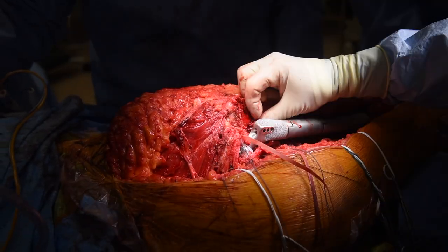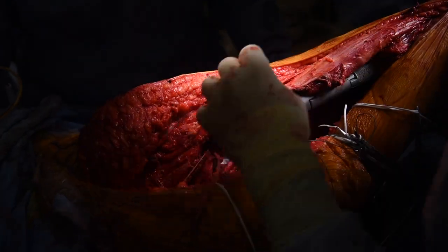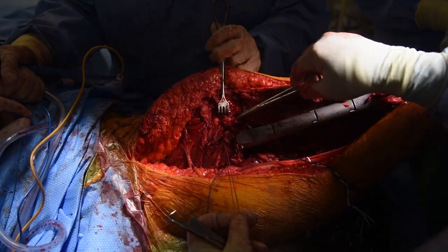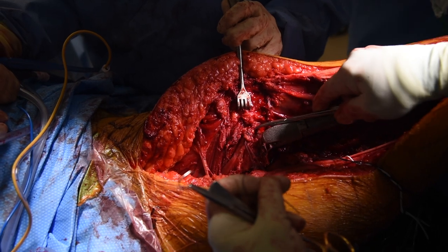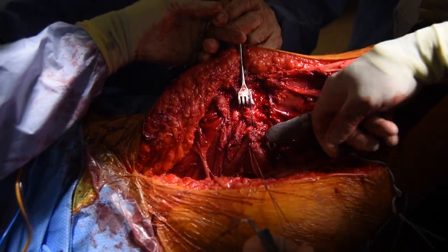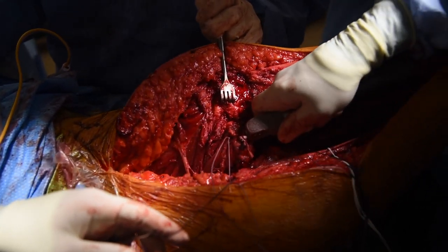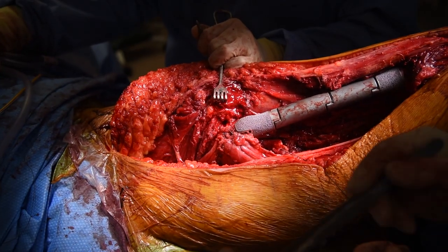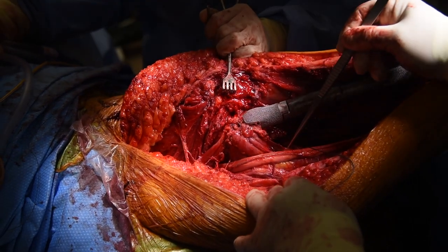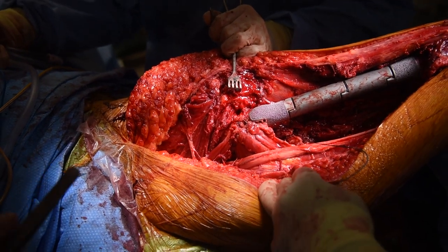The piriformis and iliopsoas muscle are brought together to reinforce the capsule and external rotators over the posterior capsule. We put the hip in abduction to repair the greater trochanter and place sutures through the hip abductors. The psoas muscle is attached to the piriformis and covers the joint capsule anteriorly. We then bring the external rotators around to cover the posterior joint capsule, protecting and preventing the prosthesis from dislocating. As demonstrated, the prosthesis cannot be pulled out of the hip socket because of the noose from the purse string method. We checked that the sciatic nerve can sublux and is loose without tension on it. When we pull on the hip we can move the entire pelvis, confirming the piece will not dislocate.